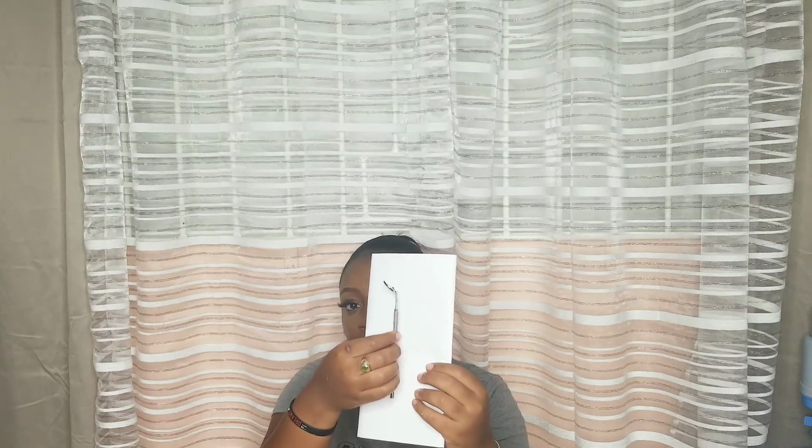When you start your cavity preparations and you start using your high-speed handpiece and slow-speed handpiece, there are a few instruments that you will need. You're definitely going to need a mouth mirror. So this is what it looks like. You're going to need a standard mouth mirror, which is a number 5. The number is on the head of the mirror to the back. When you start doing pediatrics, then you'll need a smaller one, obviously, because you're dealing with smaller mouths. So this is what number 3 mouth mirror looks like, and you'll definitely need this. So let me just compare both to show you guys the difference. So there you go, that's the difference in terms of sizes.